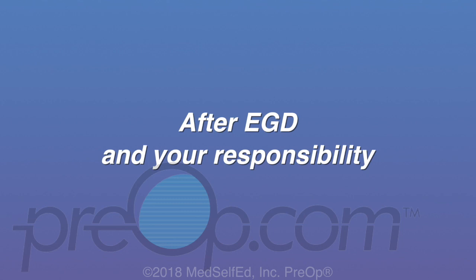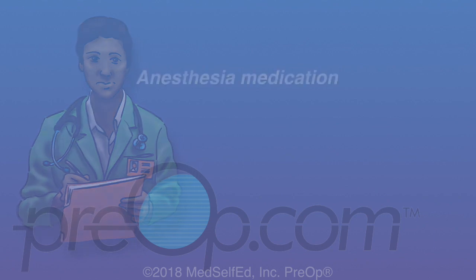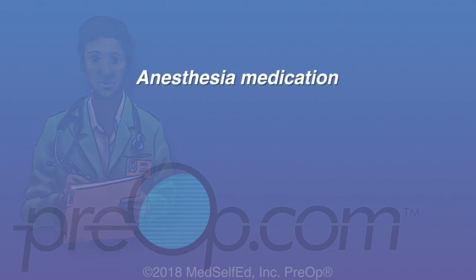Now let's learn about what may occur after your procedure, some of the risks, and what you can do to help. It is important for you to speak up and tell your care team if you have more than expected pain or problems. They will be watching for early, rare complications. After the EGD, you may feel awake quickly. However, anesthesia medication used during the procedure to help you relax or sleep can impair your thinking for several hours. Some patients notice effects for days.